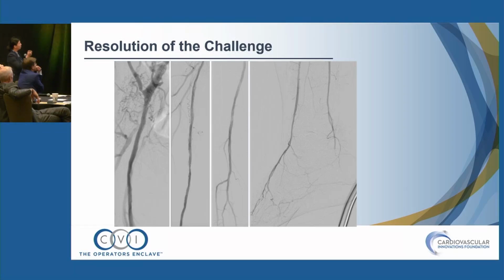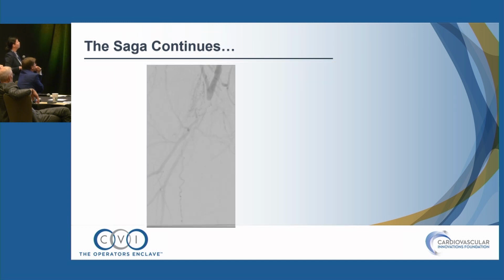I actually did balloon angioplasty, drug-coated balloon. I was quite satisfied with the outcome here, so I left him alone. I said, I'm not going to stent it. I'm not going to burn any bridges for the profunda in case something happens to the patient. Lo and behold, he comes back a couple weeks later. Hey, my leg still hurts.